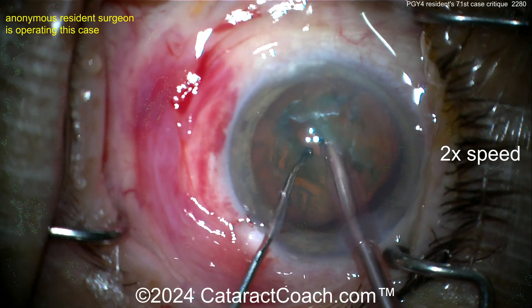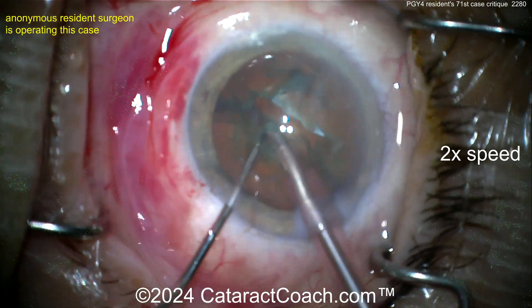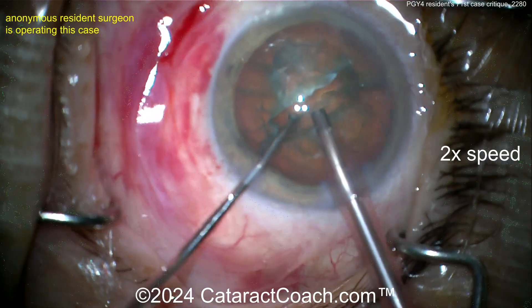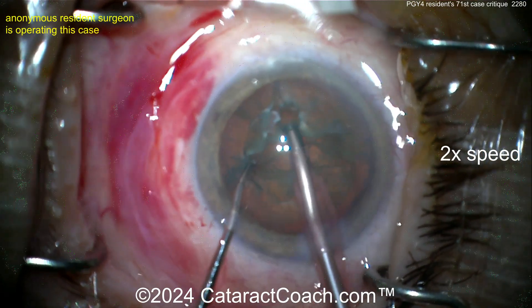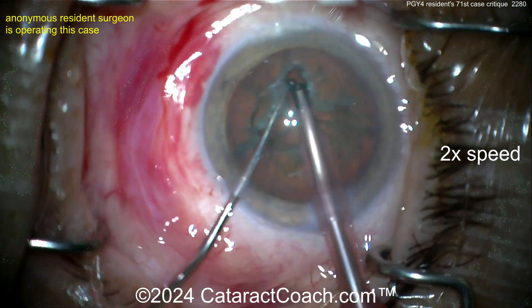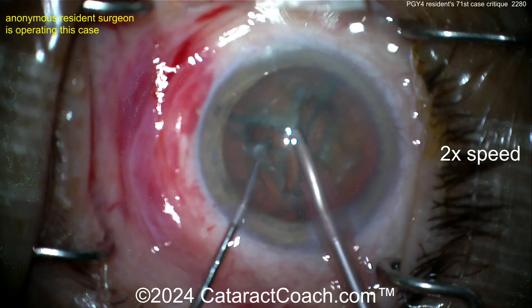With two instruments you control eye movement. There's the crack down the middle — maybe a stop-and-chop technique. Good crack, propagate it all the way through. Get this thing rotated, propagate more if needed. Looks like a groove and divide-and-conquer — very reasonable for case 71. Now another groove being created and then splitting it apart.